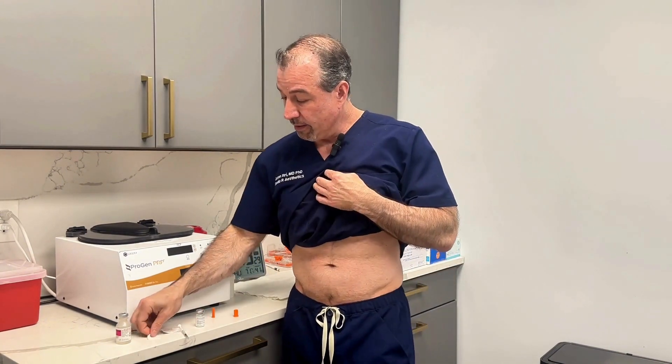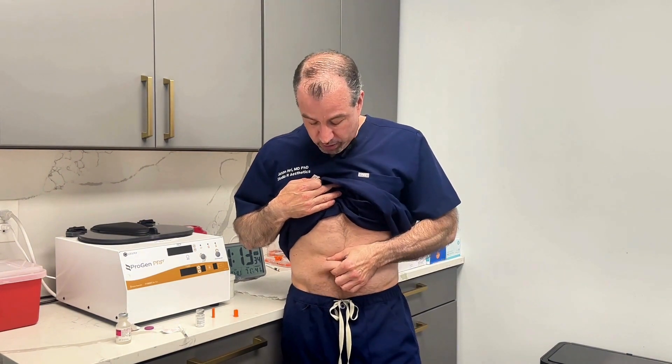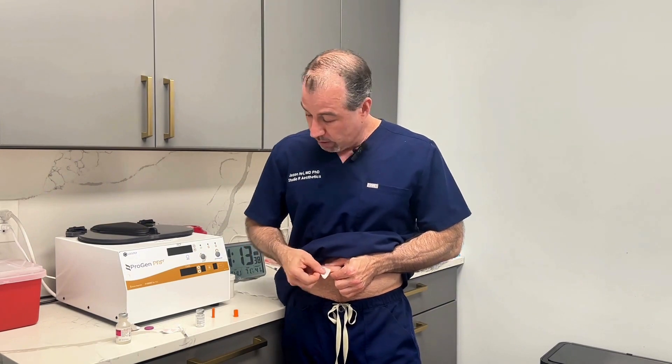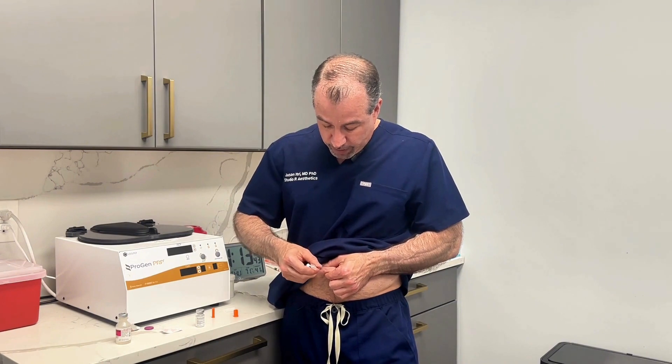So basically just lateral to the navel — pick either side, and each week you alternate. Pinch a nice piece, pinch it real hard. Wipe it with some alcohol. I say just go in at 90 degrees, right in like that.